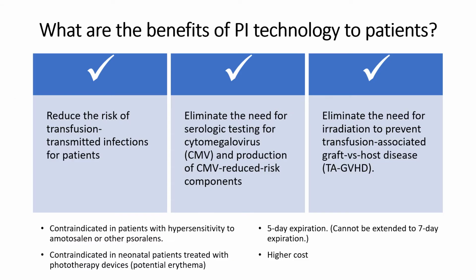So what are the benefits of PRT? Because infectious agents are pretty much destroyed, it greatly reduces the risk of transfusion-transmitted infections, including cytomegalovirus. Therefore, CMV testing is not necessary for treated components. It also eliminates the need for irradiation to prevent graft versus host disease.